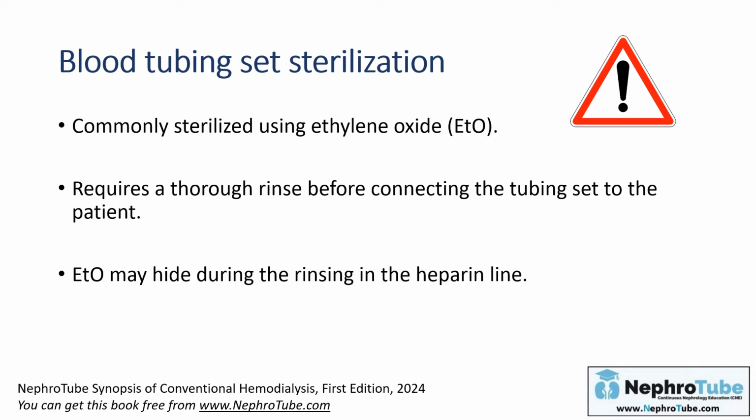And you have to put in mind that ethylene oxide may hide during rinsing in the heparin line or in any small connector or side branch of the tubing set. So it is important and essential to flush the heparin line and any other side branches during the rinse cycle to remove this hidden ethylene oxide.